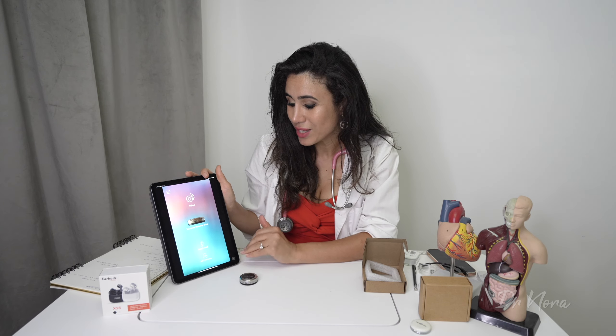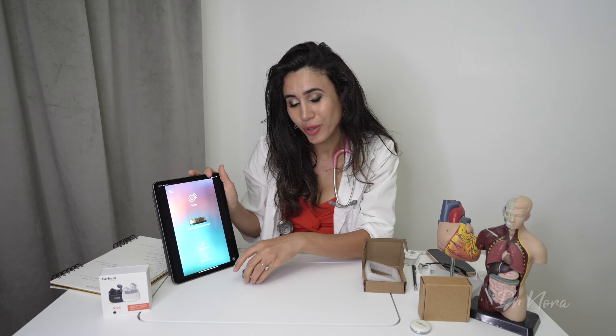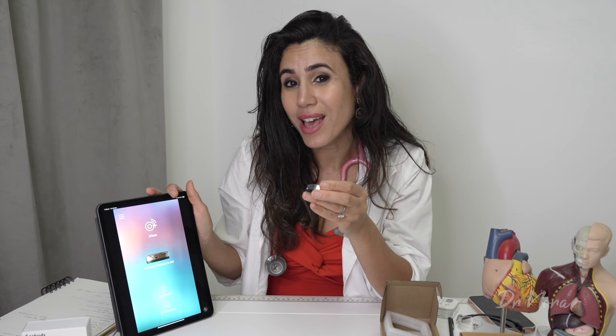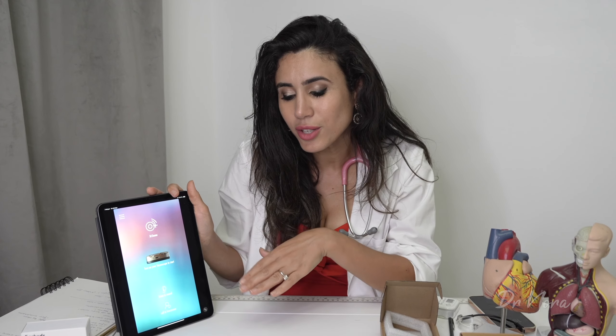You can listen, record, and even call and live stream. Because it is now FDA approved, if a patient has a Stemoscope and you're doing a telehealth consultation, you can ask them to place it on their chest and listen to their heartbeat live during the phone call — which is pretty incredible. The only rate-limiting factor is whether your patient actually has access to one.